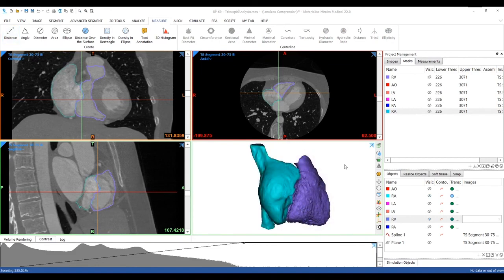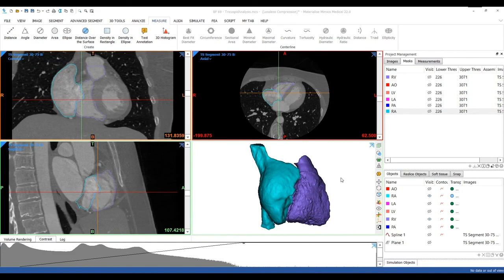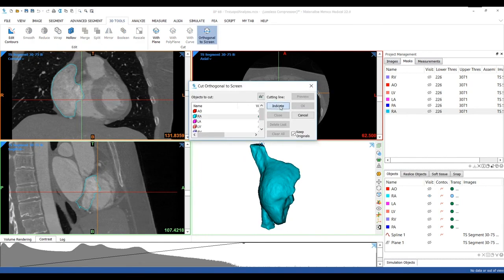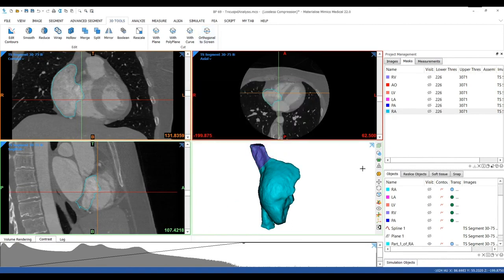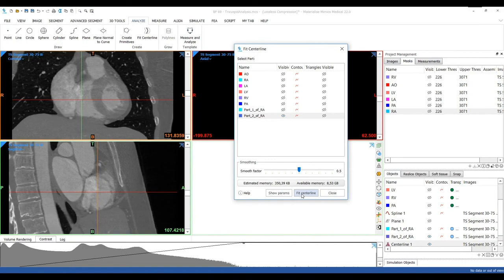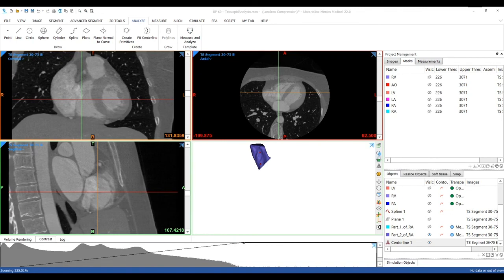Most of the transcatheter tricuspid devices will enter the heart by the inferior or superior vena cava. Some devices will even consist of a stent graft or anchoring mechanism in these vena cava, hence a proper understanding of these structures is required. We will start with creating a centerline of the vena cava for an accurate analysis. Let's use the superior one as an example. To create a centerline you need a tubular structure, so we will cut off the rest of the right atrium and then fit a centerline to the superior vena cava. Toggle on the transparency to see the centerline.